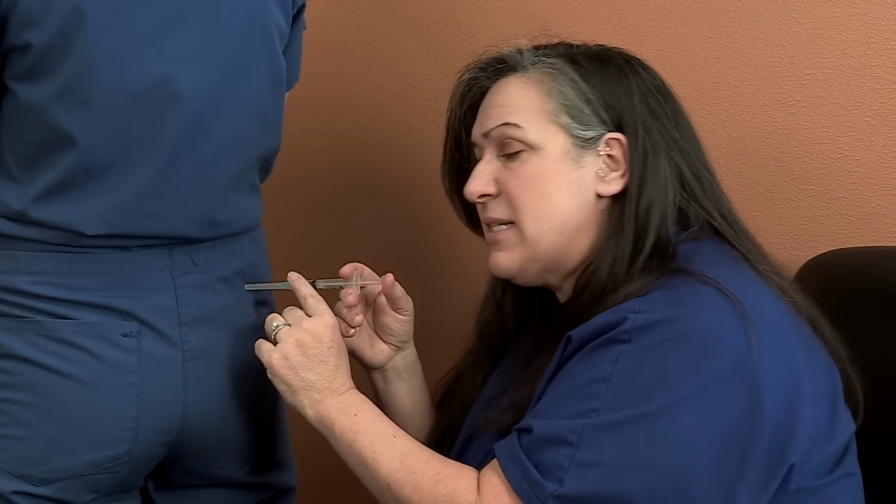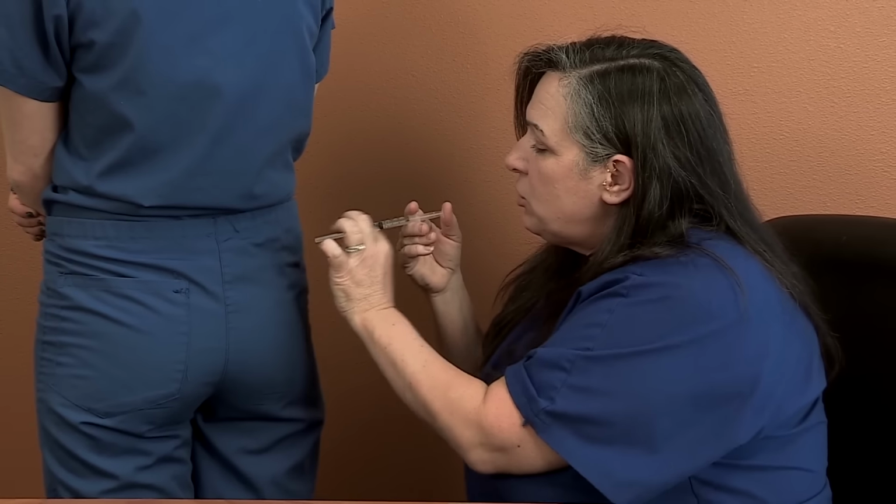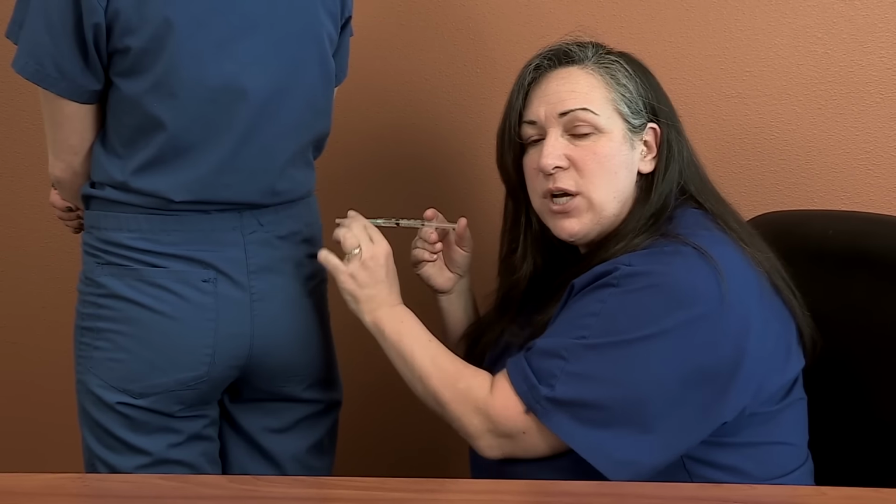Now, I don't even know if in my 14 years I might have seen this once, but if you were to ever see a little bit of blood come back out, that just means you must have hit a little capillary, no big deal, but I wouldn't want to do the shot right there. So I would pull that out, probably get a whole new setup and move to the other side and do the injection. Otherwise, when you're doing the injection, I use just the weight of the resistance of the medication to do the shot.